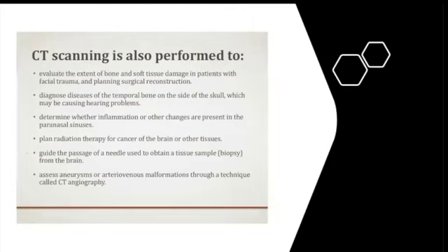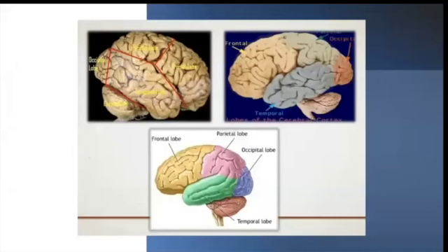These should include if you're evaluating your patient prior to surgical reconstruction, if your patient has any sort of hearing loss and you're thinking maybe the etiology is from the bones. So if you're thinking of any bone etiologies for hearing loss, then you should also order a head CT. If you want to assess the paranasal sinuses, maybe you're trying to take a biopsy and you need to guide that biopsy, a CT scan will be very useful. If you want to assess any aneurysms or AV malformations, then a CT angiography is going to be your go-to technique.